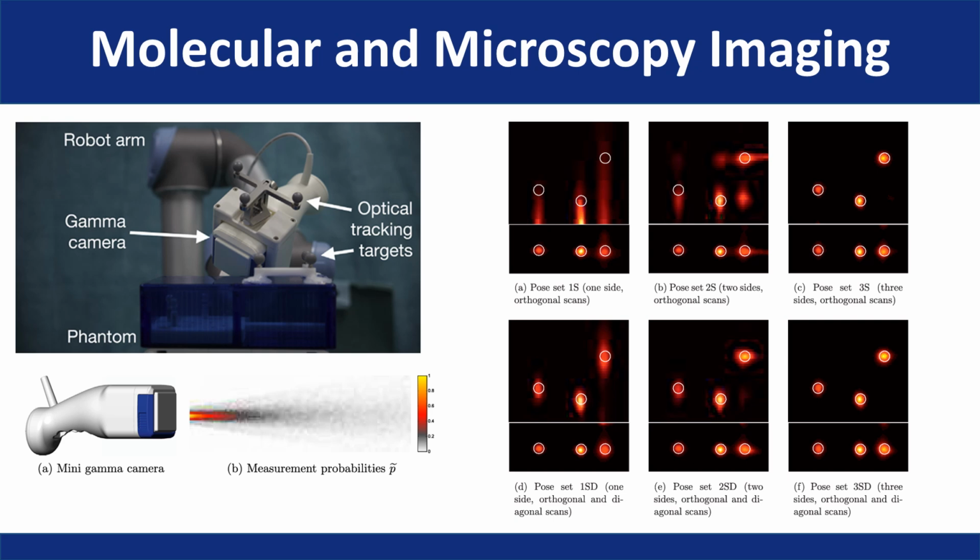Calibration of the mini gamma camera. In this figure we see the calibration process. Subfigure A shows a rendering of the mini gamma camera, highlighting its compact design. Subfigure B reveals a cross-sectional view of the camera detection model generated through precision measurement using a radioactive point source. This calibration ensures the system accurately models how gamma rays are detected, enabling reliable reconstruction of hotspots during surgical procedures.